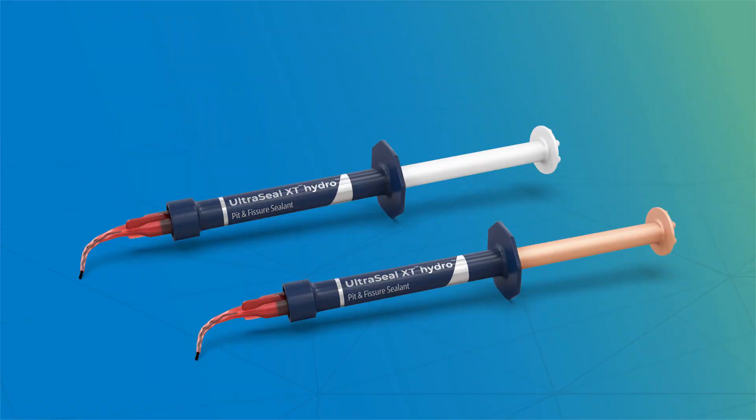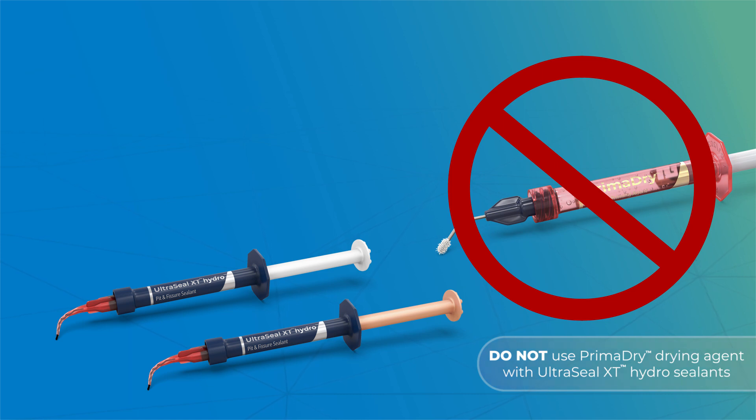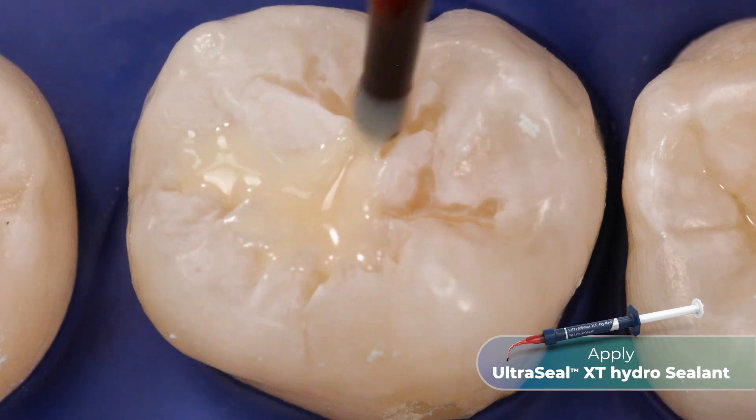Before you begin placement, it's important to note that Prima-Dry drying agent should not be used with UltraSeal XT Hydro Sealant. Express a small drop of UltraSeal XT Hydro Sealant into the grooves.